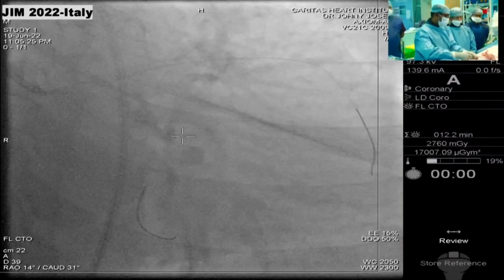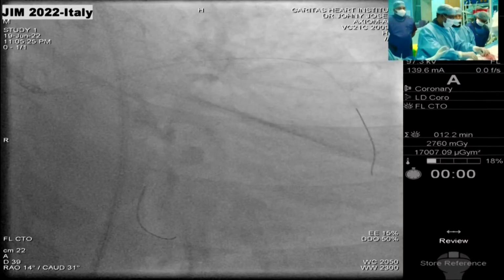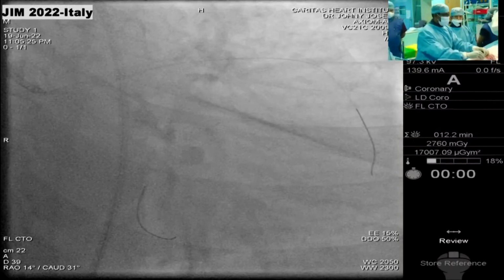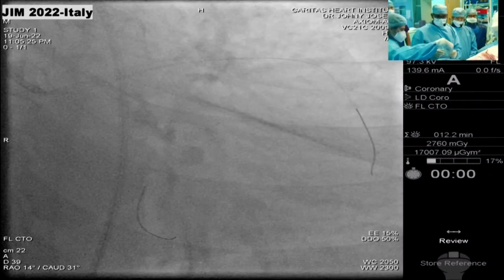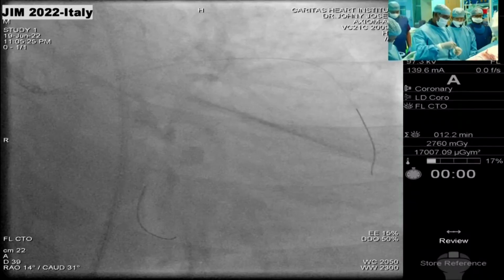We could, but I think particularly in this case, they get a good idea with the angulation of the catheter, etc. So I would say they're lucky to be able to do it here. Probably to look at the left main ostium, LAO cranial would have been better. It will be more precise, I would say. I guess that's again precise PCI. Maybe an extra look from the left LAO cranial would be helpful here by the panelist.